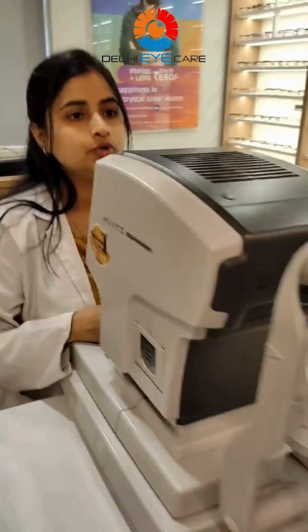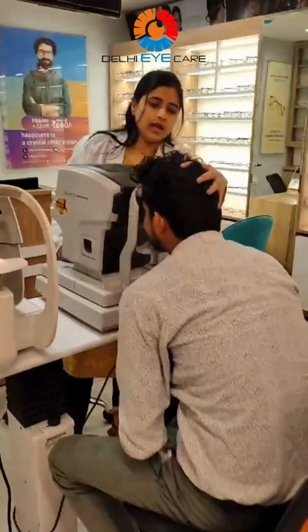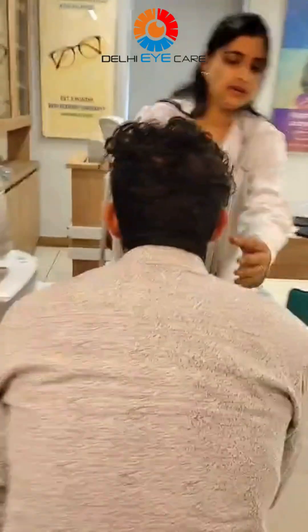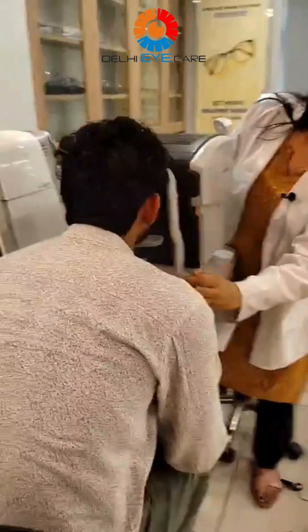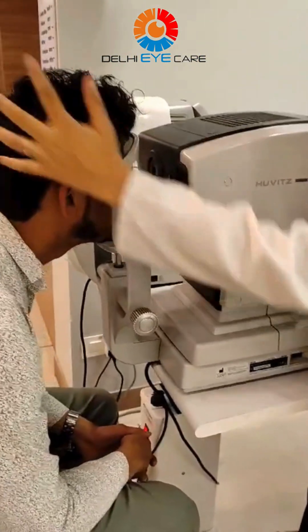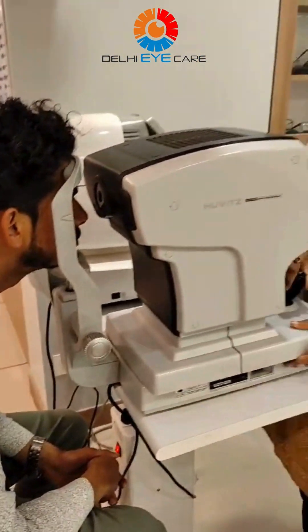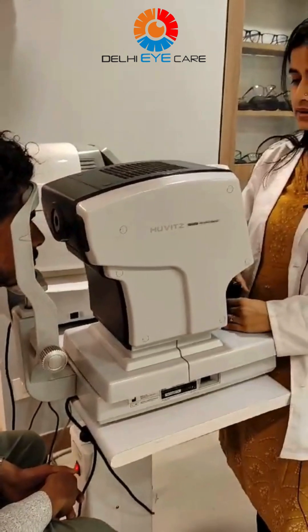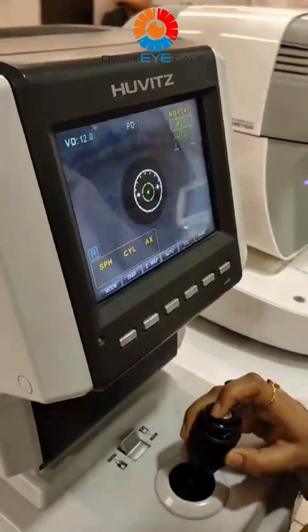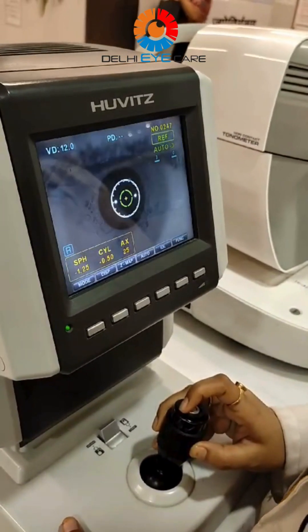So what we are going to do is we are going to place the patient over here, and we are going to match the alignment of the eye with the canthus. Then we are going to ask the patient to look inside, and there will be a target — like a parachute — which will be visible to the patient.